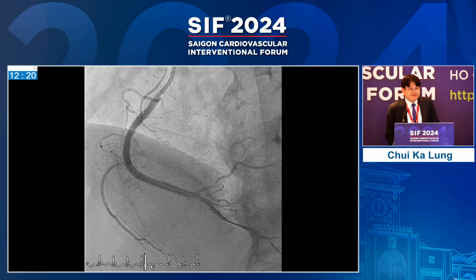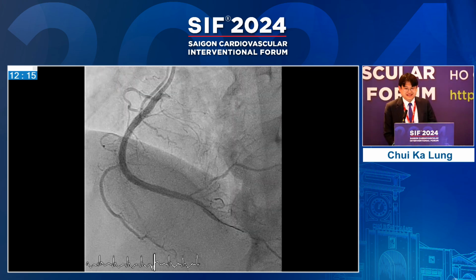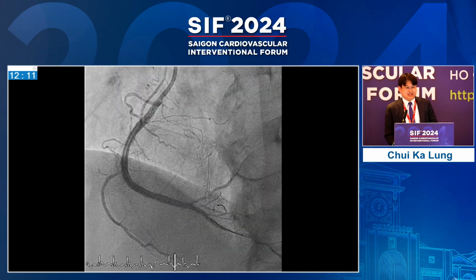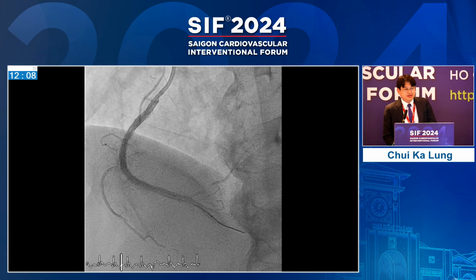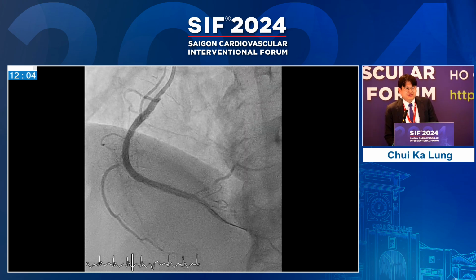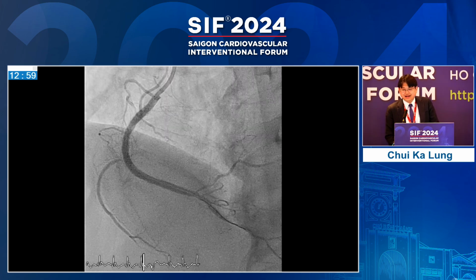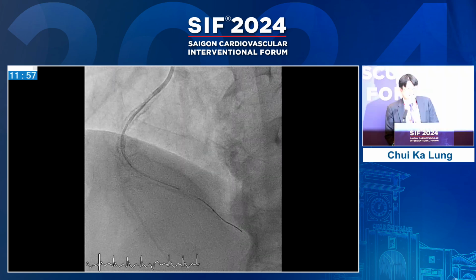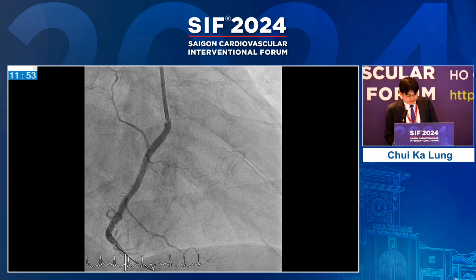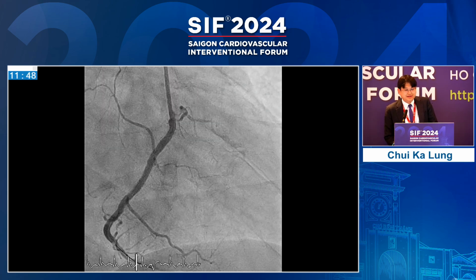So at that point of time, because it is an NSTEMI, although this is nearly subtotal occlusion, we found the LAD CTO, which this patient initially refused, and we asked the patient on table. Patient is very keen, and he's not willing to come back for another staged procedure. So because of this very smooth procedure in the RCA, we decided to proceed to the same session PCI to LAD CTO. And you can see the retrograde filling to the LAD.